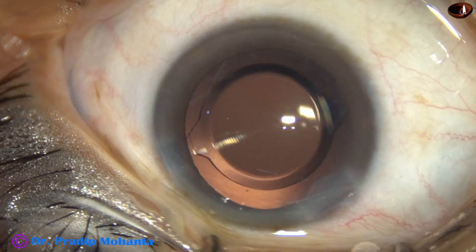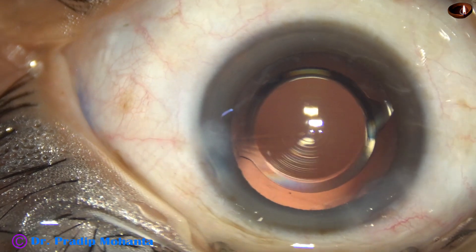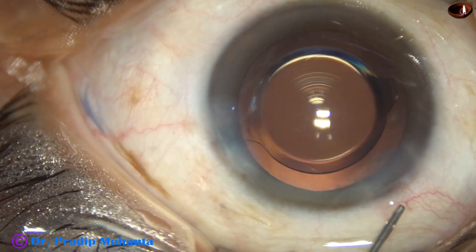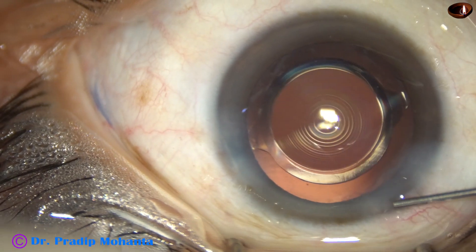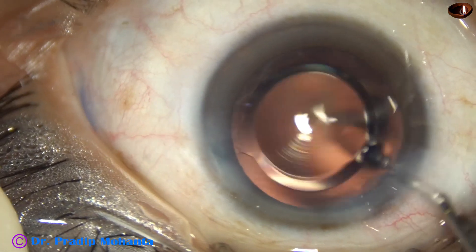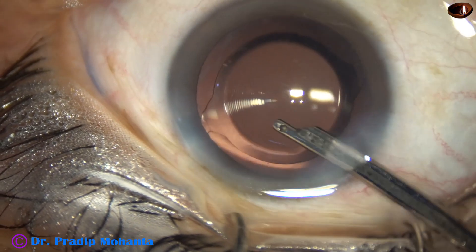This is moxifloxacin. Then the side port is nicely closed by hydrating the corneal stroma. The main wound usually doesn't require hydration, but in this case I didn't take any chance — hydrating a little bit the sides of the main wound. This is the final lavage of the anterior chamber; any visco sticking to the corneal endothelium is removed at this time.